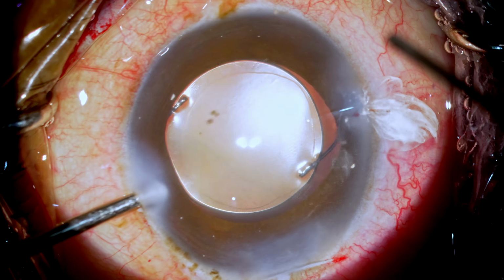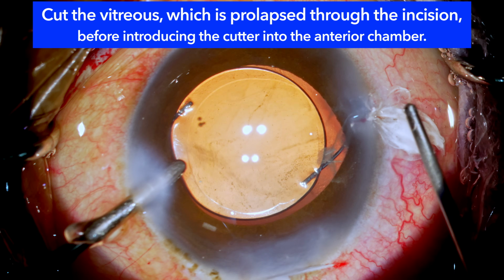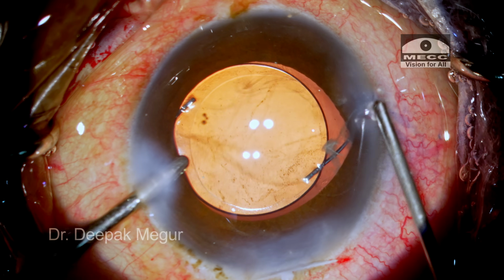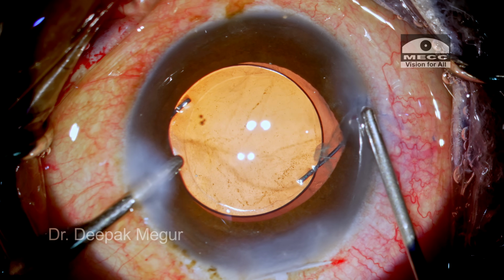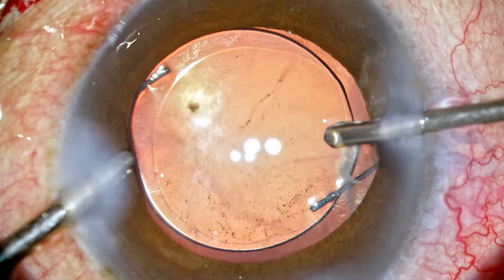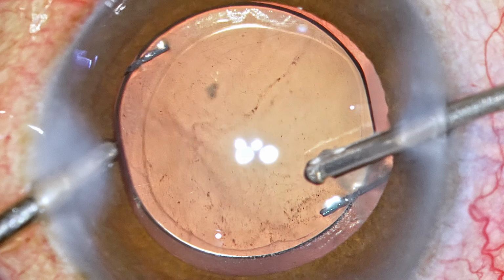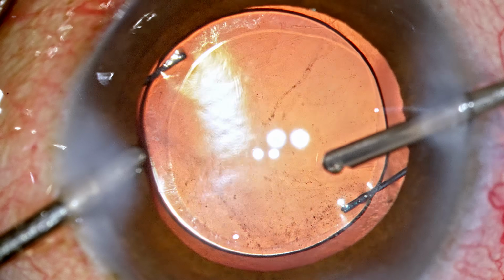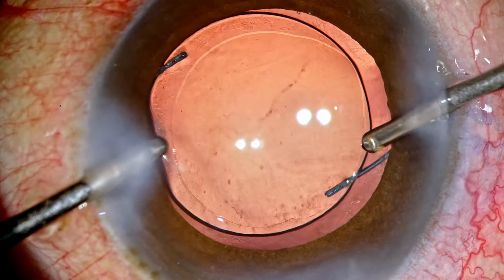So how do we deal with it? The first thing to do is cut the vitreous at the wound itself before introducing the cutter into the eye. The moment we cut the vitreous at the wound, the part of the vitreous which is prolapsing from the zonules and into the incision falls back a little bit. Then we can introduce the cutter inside and the vitrectomy is continued. But one needs to be very mindful at this stage that we don't damage the iris as well as the rhexis margin, which are in close vicinity. So it's important to be mindful of this fact.